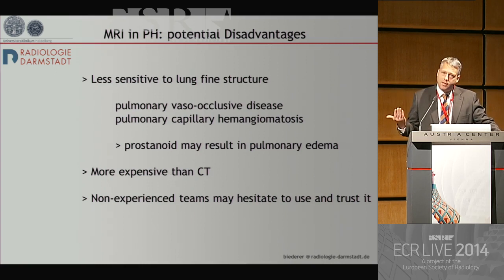Always having the idea in mind that we want to take MR as a single examination, working up a completely unclear patient. So of course, it may be more expensive than CT, depending on the setting. And of course, an argument that you will frequently find is that non-experienced teams might hesitate to use and trust MR, at least as a single examination.